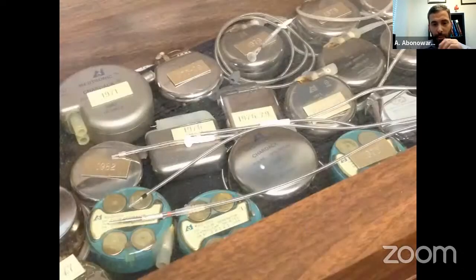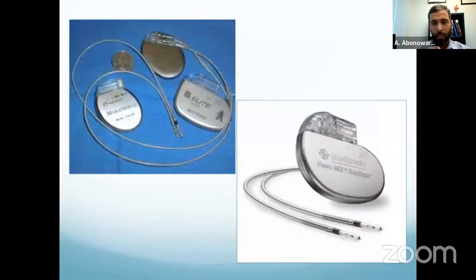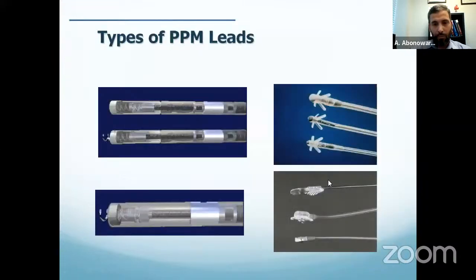This picture from our pacemaker clinic shows how big those pacemakers were, and they were very preliminary. Some of these pacemakers lasted only a few months, and they were very heavy. They had lots of issues and complications. This is just part of the history. And now these are the new pacemakers. Most of them are small, like this one here, and they have more longevity. The expected longevity of pacemakers is very high, up to 10 to 15 years these days. And they're very small, very convenient, with less risk of complications.